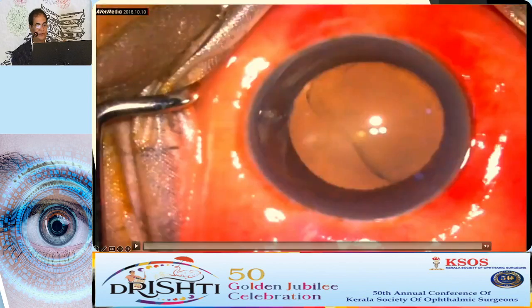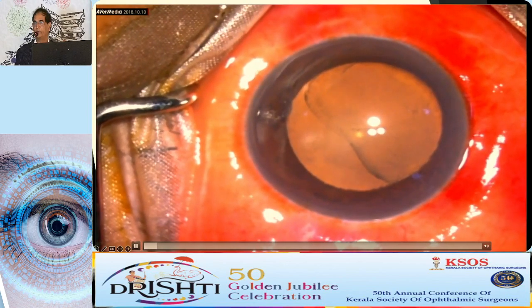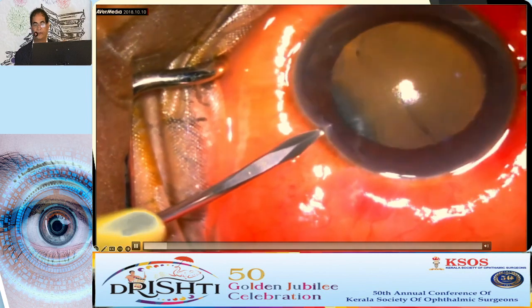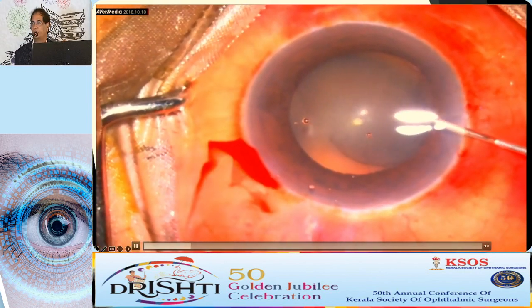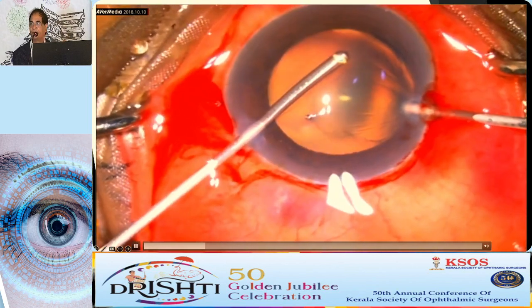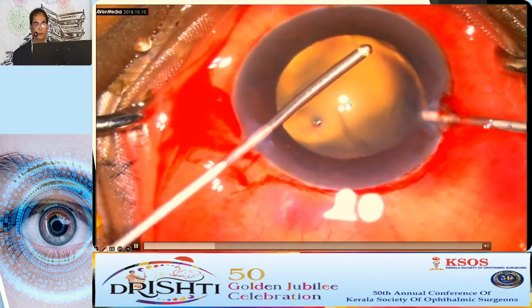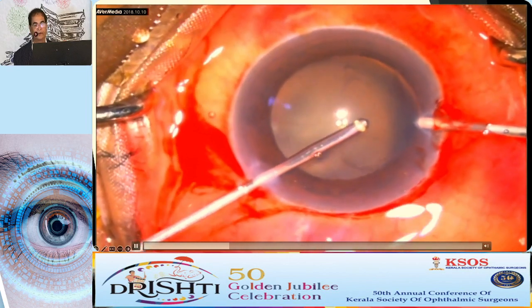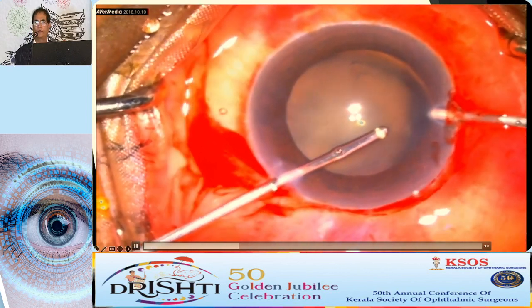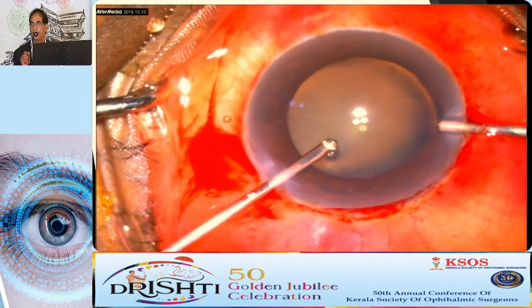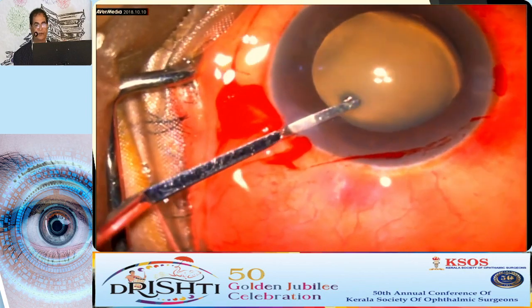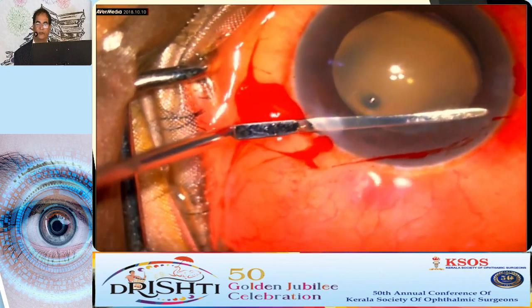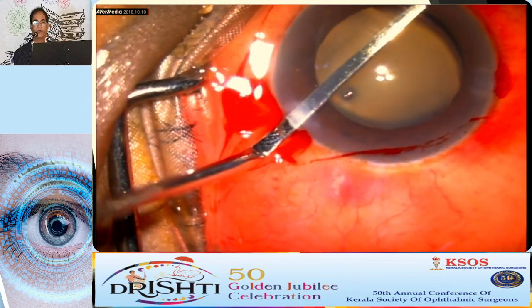This is a case with pre-existing vitreous in the anterior chamber. If vitreous is in the anterior chamber you cannot do anything else — it will not allow you to do rhexis and will keep coming into your probe. So the first thing is to remove the vitreous. However thorough your vitrectomy is, some vitreous strands will remain in the section or side ports. Be careful and remove those strands — you can bring them into the centre.